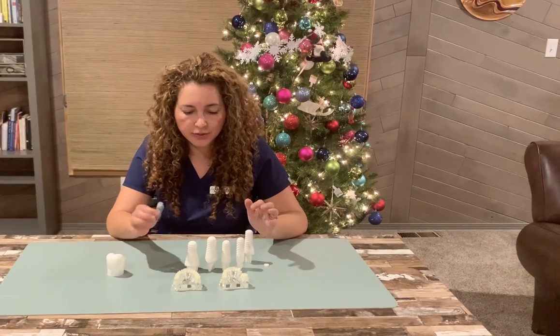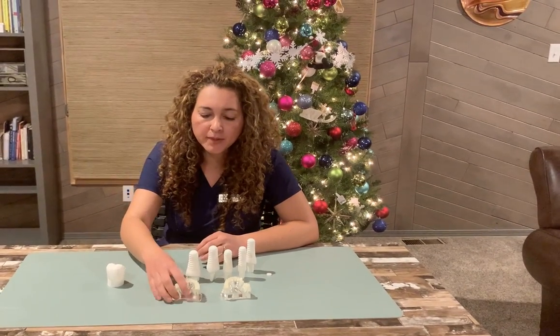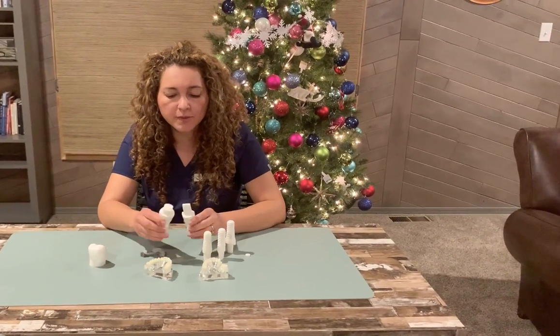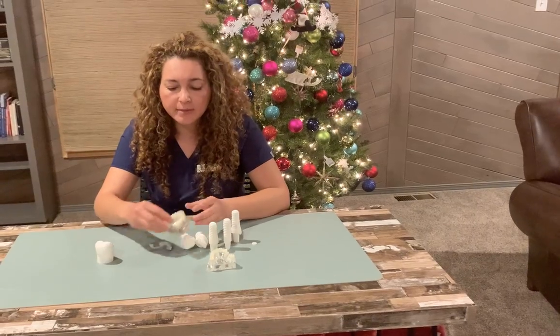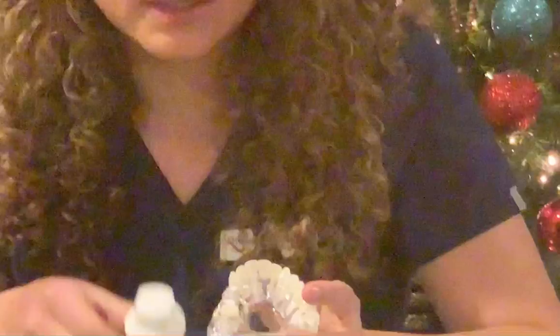Once we have the surgical guide ready, we're ready to schedule the appointment. At the appointment, we place the implant — we already chose with the tomography which implant you're going to use, because Seren root has different shapes for different areas of the mouth. When we place the implant in the surgery, we're going to control it as one piece, and we know exactly how the inclination is going to be.